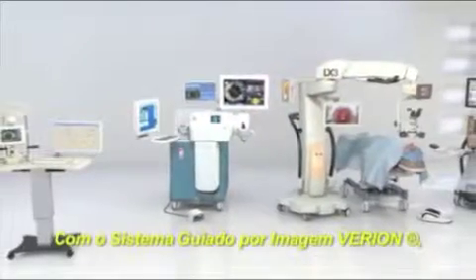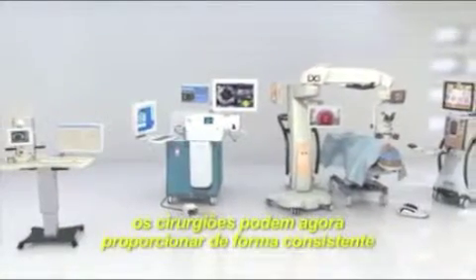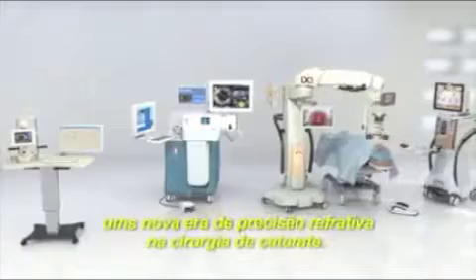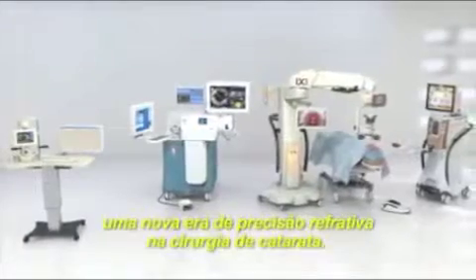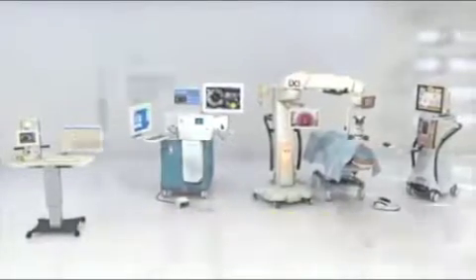With the Varyon image-guided system, surgeons can now consistently deliver a new era of refractive cataract precision.